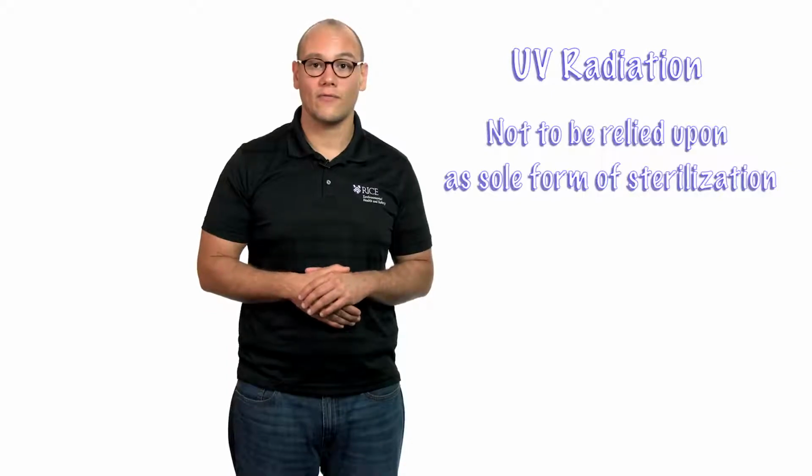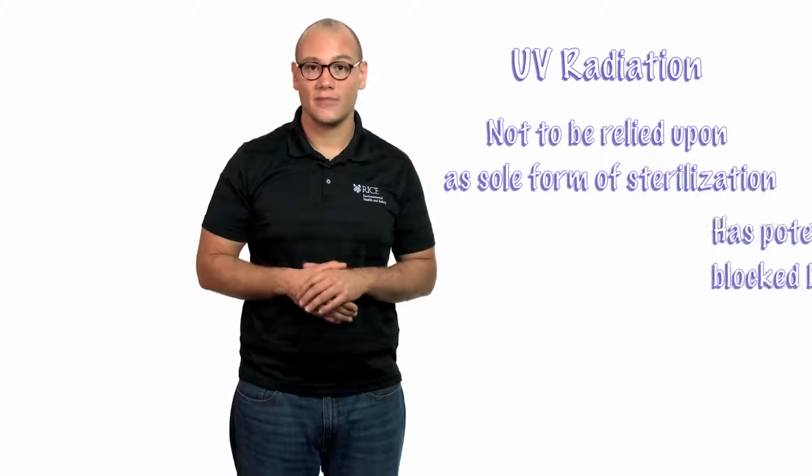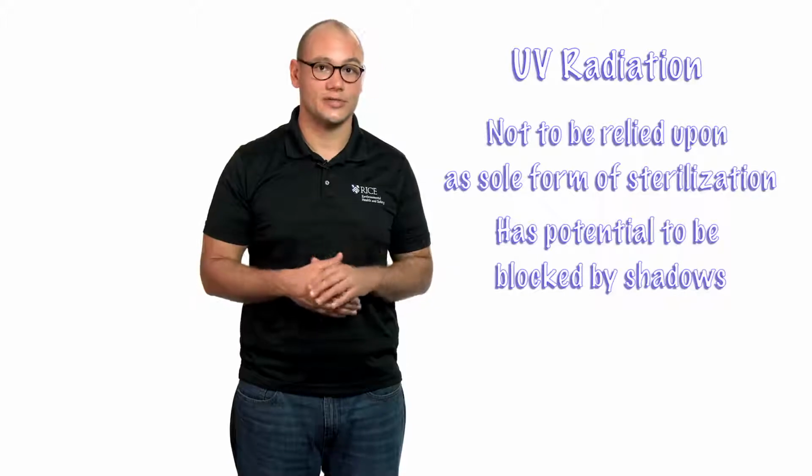A less common form of physical disinfection is the use of UV radiation. UV radiation is not recommended to be relied upon as a sole form of sterilization or disinfection because it has the potential to be blocked by shadows.